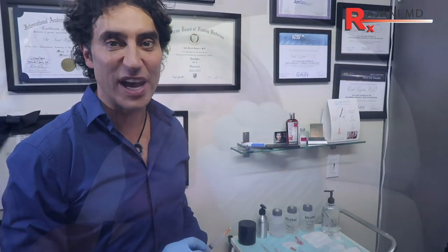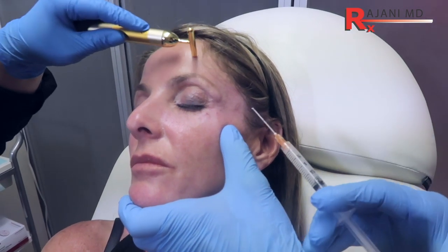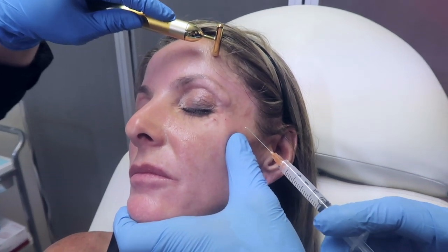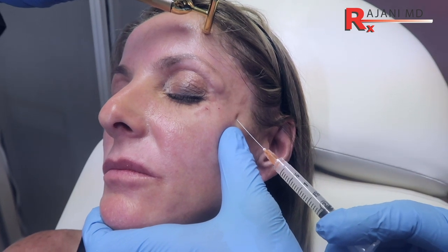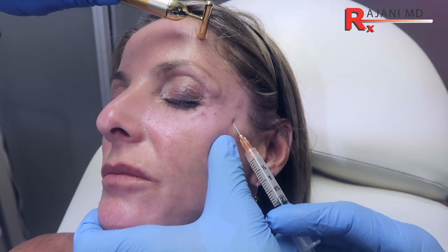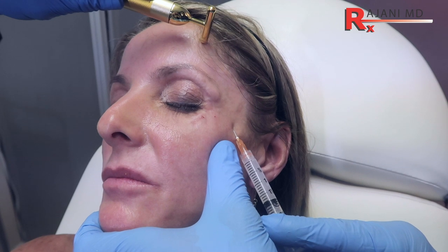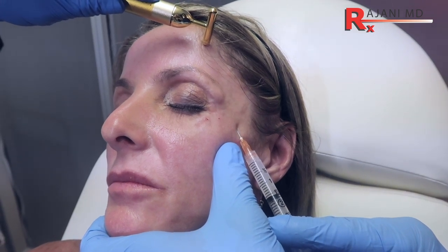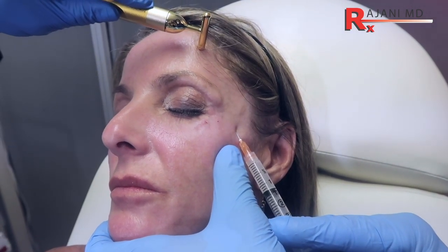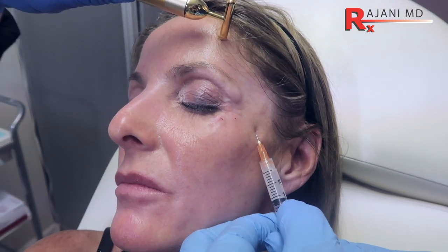Here we're filling the temple, feeling the zygomatic bone, stabilizing the face. On the patient's left you try to inject just like on the patient's right, so you have to change your mindset a little bit — it's counterintuitive. Coming down, pull back ever so slightly; you're just looking in the hub of the needle to make sure it's clear. If you were in a vessel it would be very obvious because this is a liquid, not a gel.